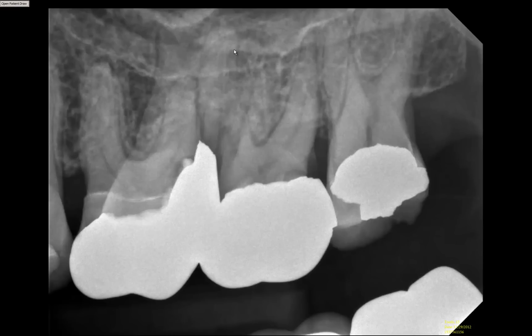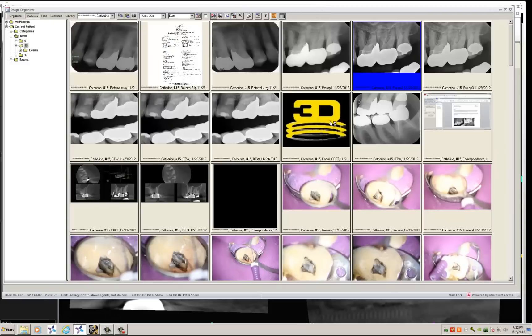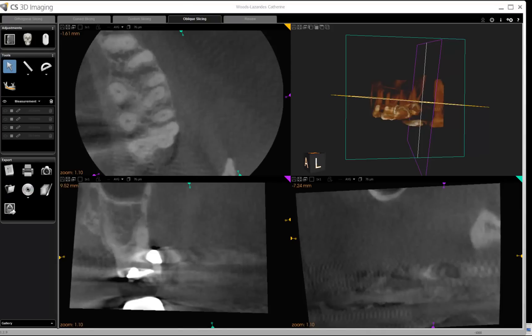You can see from the x-ray it looks like some complicated anatomy. The first thing you do is double-click on your 3D icon and that will load the CareStream viewer for you. When the viewer appears on the screen, for measurements we recommend that you go directly to oblique slicing. In the oblique slicing view, you have orientation handles colored according to the particular view that they represent.